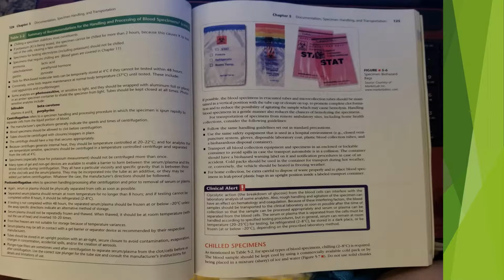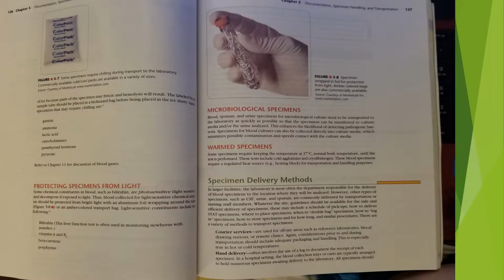Do not use solid chunks of ice because parts of the specimen may freeze and hemolysis will result. The labeled blood sample tube should be placed in a biohazard bag before placed in ice slurry. Again, specimens that may require chilling are gastrin, ammonia, lactic acid, catecholamines, parathyroid hormone, pyruvate.